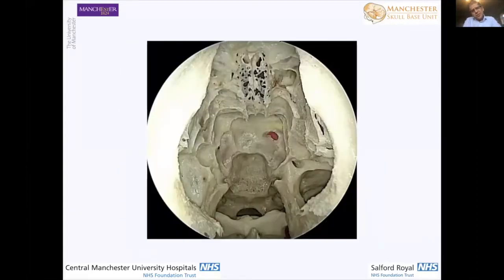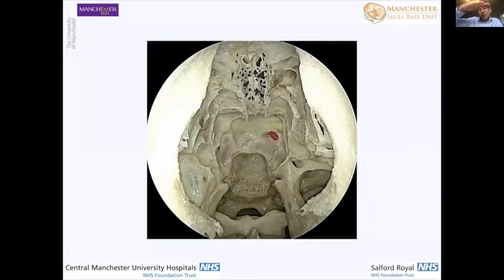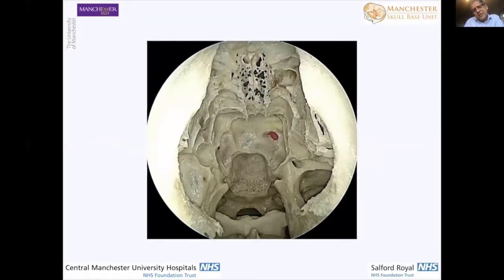Starting at the top of the screen, in terms of reconstruction, you can see how the orientation of the skull base changes. As we go from the top of the screen to the bottom, the orientation changes from horizontal to pretty much vertical. Different factors come into play when reconstructing clival defects.